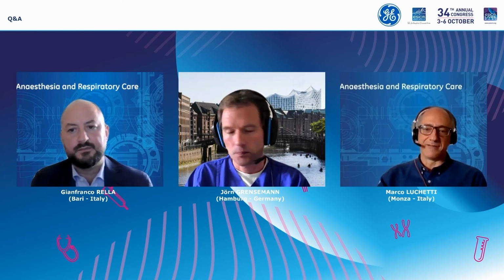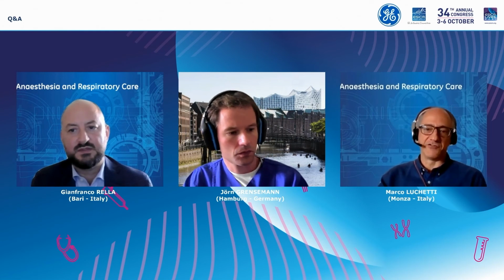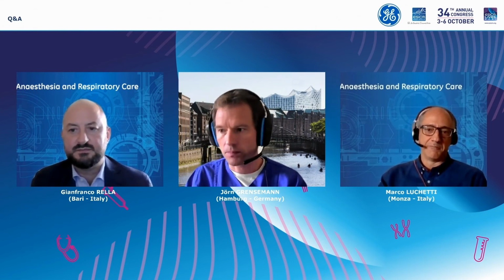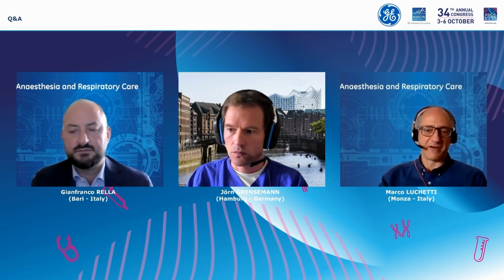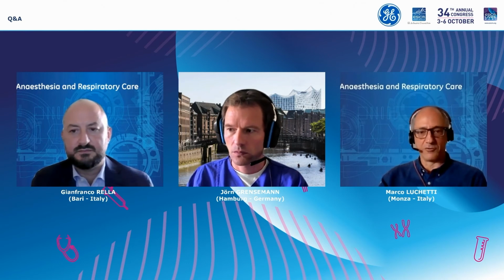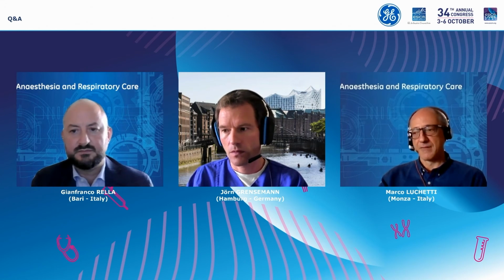So your point is essentially the same for the VCO2. Yeah. It's maybe acceptable if you don't have indirect calorimetry, but indirect calorimetry remains the gold standard and is strongly suggested to have. Yeah, absolutely. Thank you. Yeah, thank you.